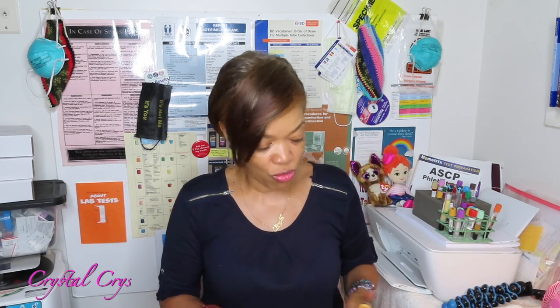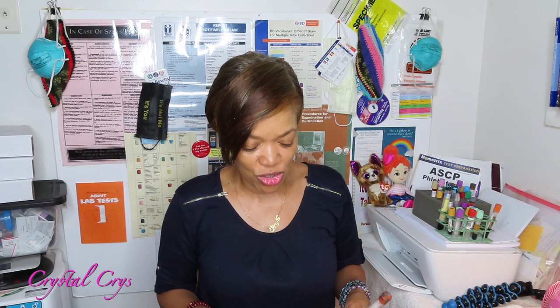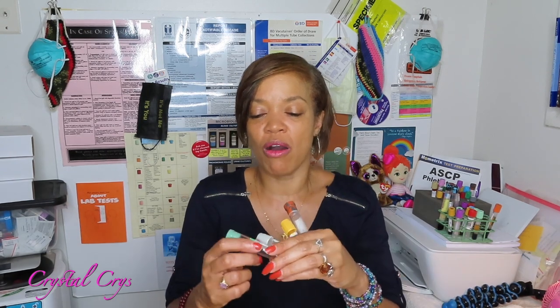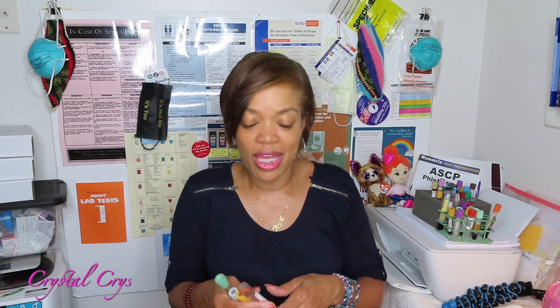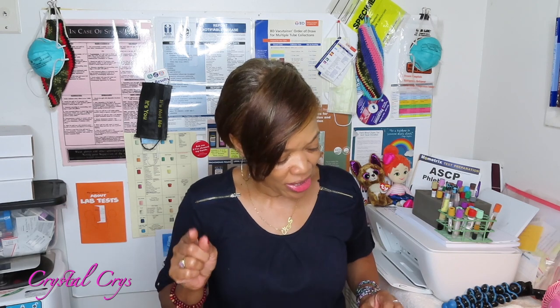Today we are going to go over our gold and tiger top tube, our gray top tube, and our dark green top tube. Please don't sleep on the labels that are on your tubes. If you're not familiar with something or concerned about what's in the tube, read your tube labels before you stick someone. You want to do this before you go in the room — you don't want to be in a hospital setting fumbling with your tubes trying to figure out what's what. So let's jump right into our tubes.